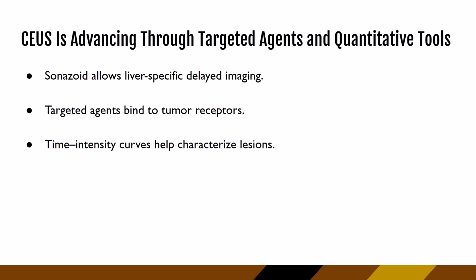We're also seeing that newer agents are being designed to bind to specific tumor markers, so that can help identify if those contrast agents show up in a nodule. That might help us to diagnose it a little bit more effectively.